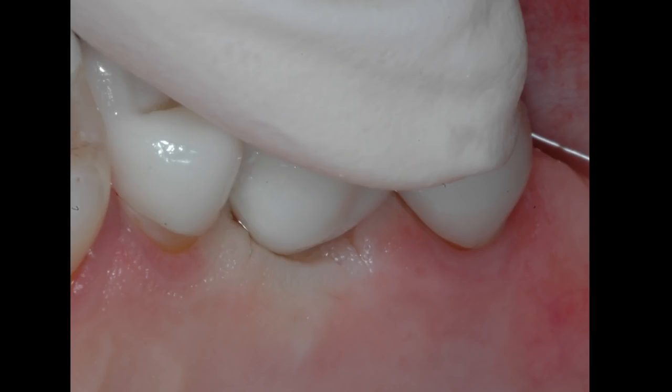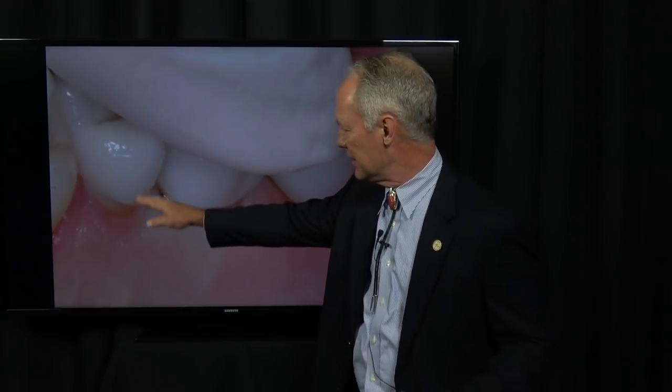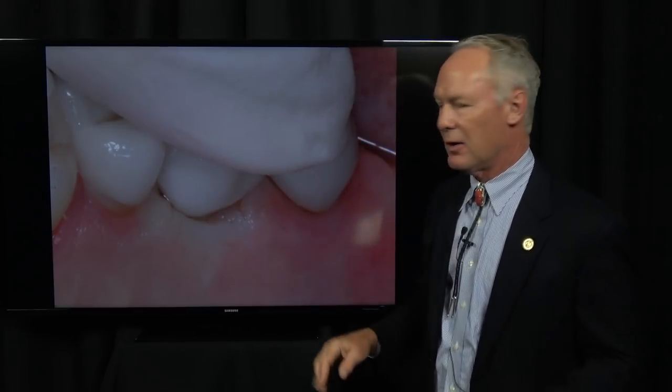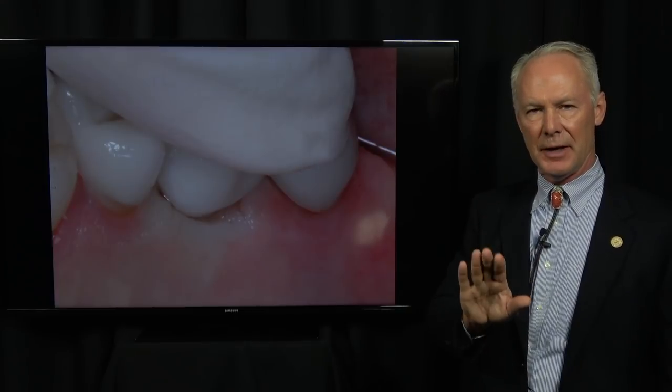See the blanching on the facial, and here's the blanching on the palatal. Something critical with a fixed bridge: you don't want embrasure spaces on the palatal. This is not seating completely just yet — that tissue is compressing. Why no embrasure spaces palatal? It's not in an aesthetic zone, you can't see them, and if you have big embrasure spaces it's going to pack food. Make these areas flat. You want the restoration to contact the tissue on the palatal, even in the anterior.